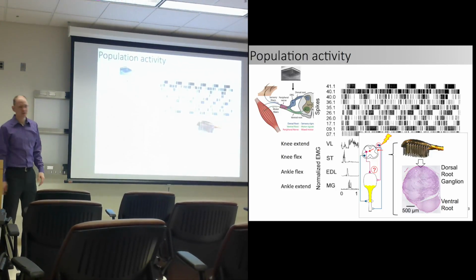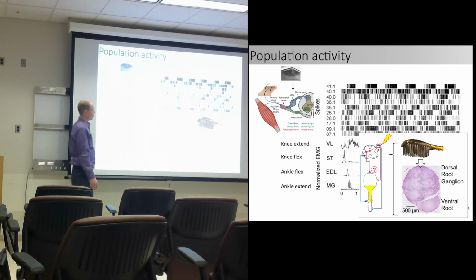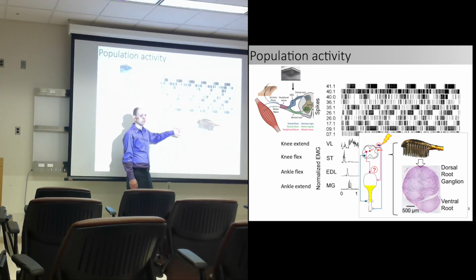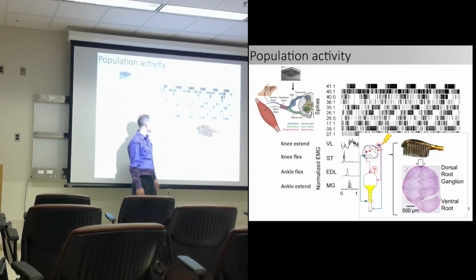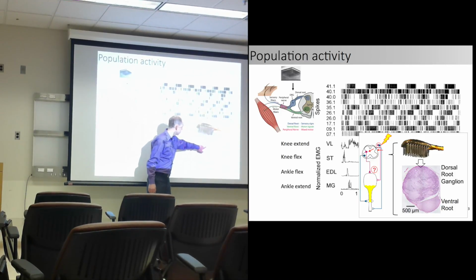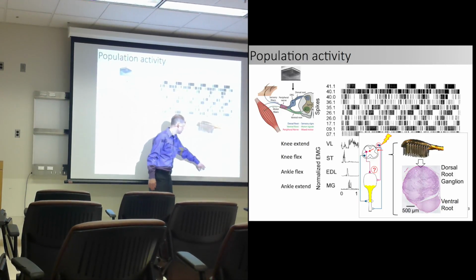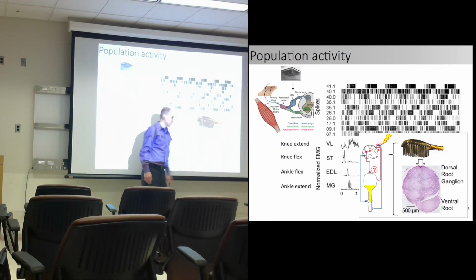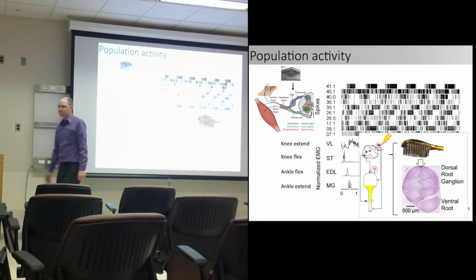And then the question I asked is, well, can we do the same thing and take our electrodes, put them in the sacral level of those ganglia, and monitor and modulate them for a neural pathway? In this case, this is a cross-section of a feline spinal root. We have dorsal root ganglia up top, with cell bodies, and on the bottom is the ventral root, all the axons, from the histology.